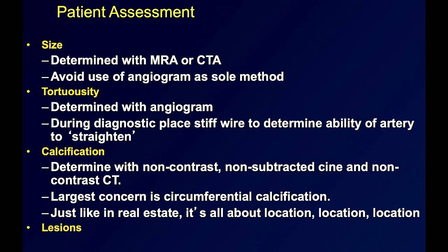So what we do is we put a small pigtail catheter into the aorta, just like for an aortogram, and send the patient for a CT scan and inject about 20 cc plus another 20 cc diluted contrast, so total 40 cc, 1:1 dilution, and do the CT scan. That will give us, with a minimal amount of contrast, the annular sizing of the valve correctly, and non-contrast for the peripheral is all right.